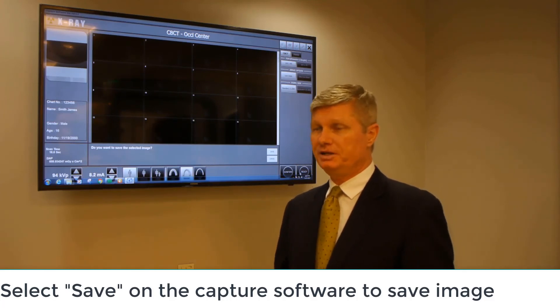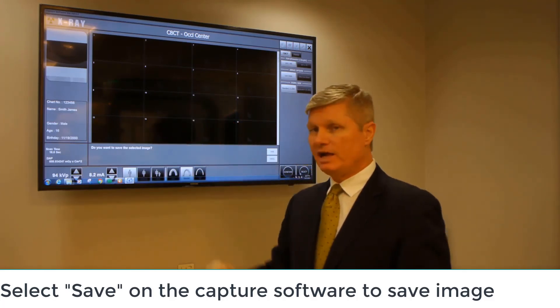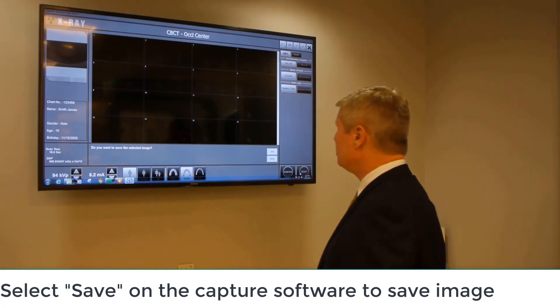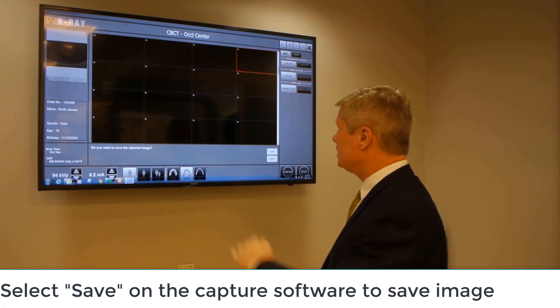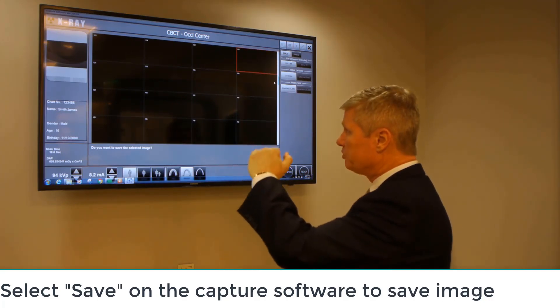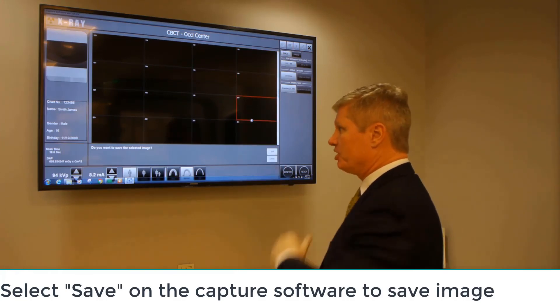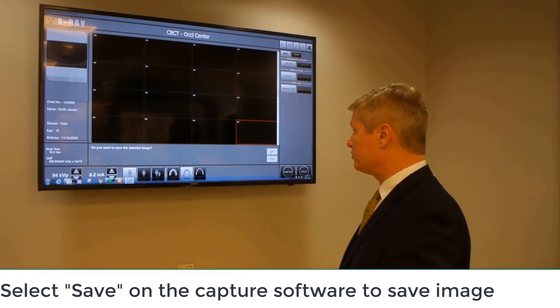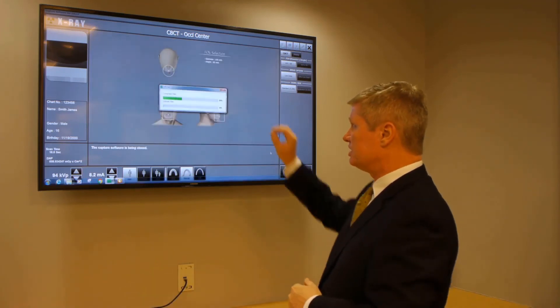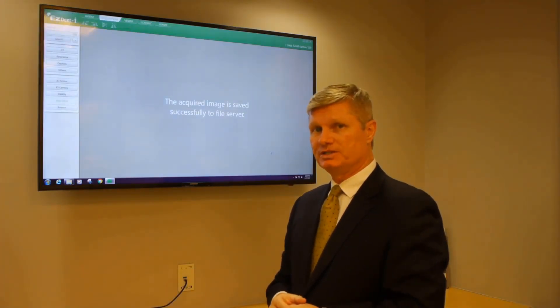Our image capture is completed. We have the view of our transaxial slices of our scan, which we can scroll through by clicking on the scroll bar along the right-hand side. Once we've verified the capture of our anatomy, make sure to click Save in the bottom right-hand corner to save the scan within the EZDent Eye imaging software itself.